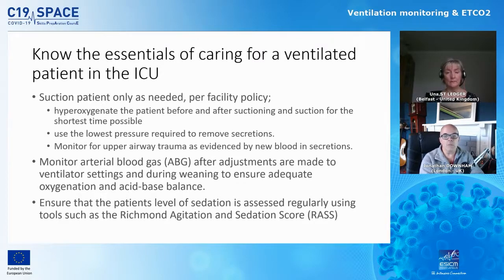But some of the important points is that it's sensible to hyperoxygenate the patient before and after suctioning. Most ventilators these days have a little button you can press, which will give them 100% for a couple of minutes. So if you do that before, then hopefully they're not going to desaturate and become hypoxic for any period of time. Try and suction for the shortest time possible.